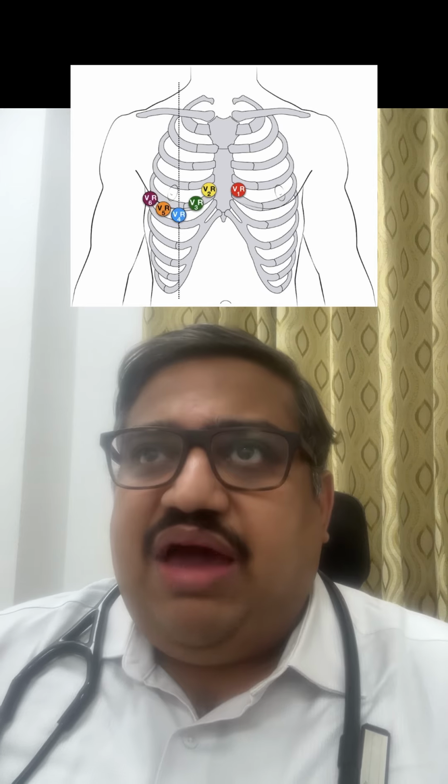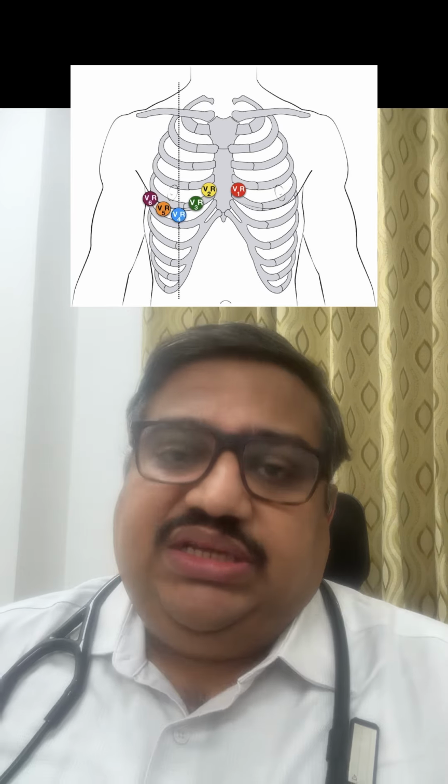So whenever you have a suspicion, or you have a patient with an inferior myocardial infarction, it is mandatory to take a right-sided ECG. So how will you take a right-sided ECG? That's a very important question. You want to take a right-sided ECG.